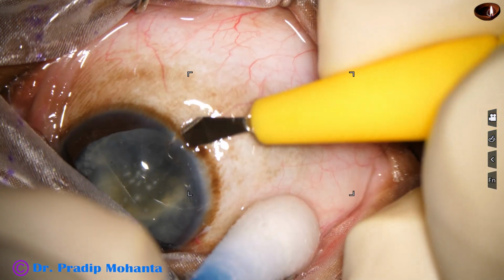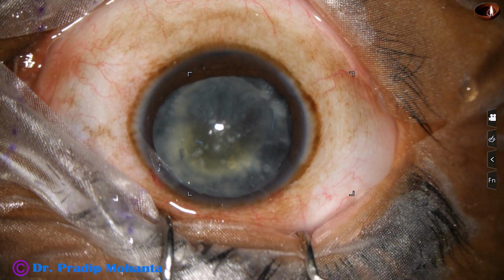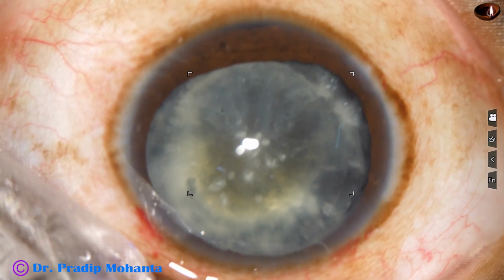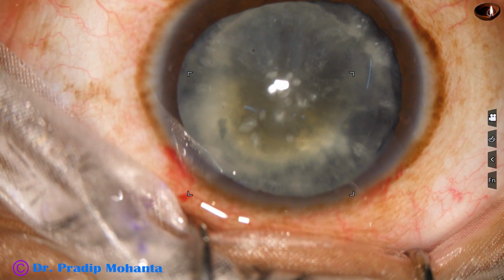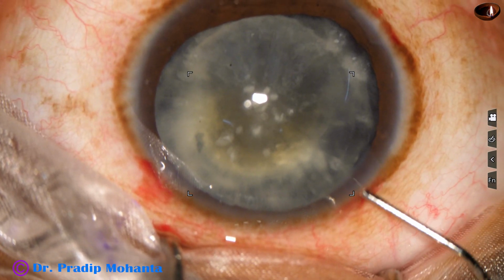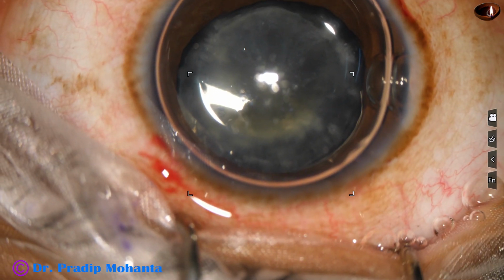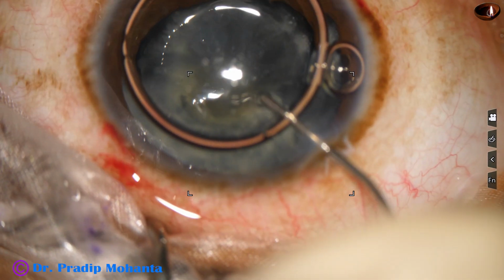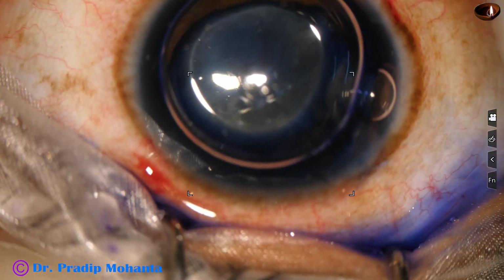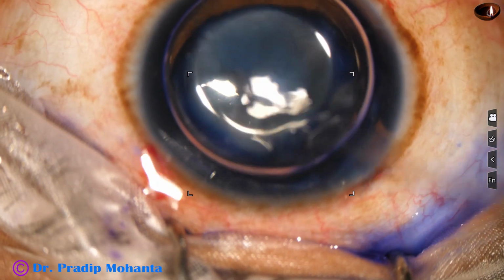The main incision and two side ports have been made, and now the cataract is almost white. So I plan to stain the anterior capsule with trypan blue dye. An air bubble is injected. Beneath this air bubble, trypan blue dye is applied over the anterior capsule. Care is taken so that the dye touches all parts of the anterior capsule.